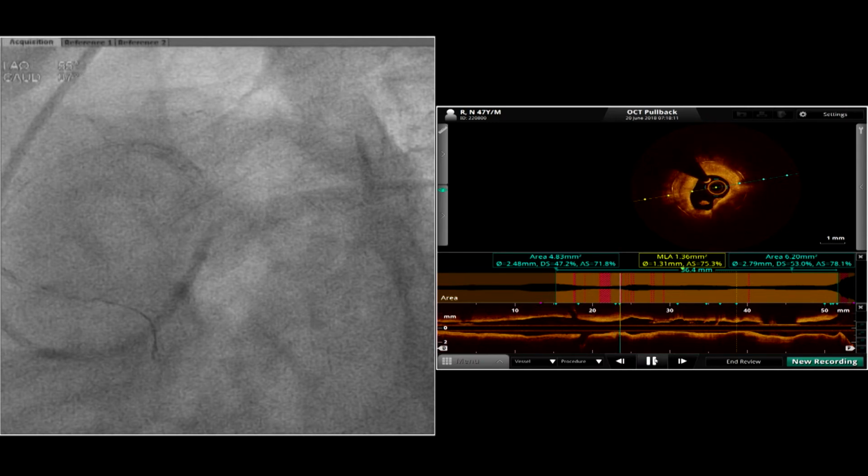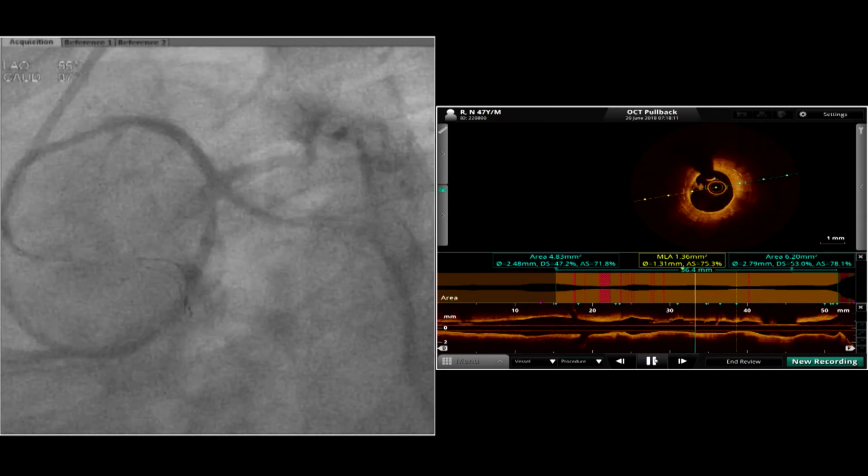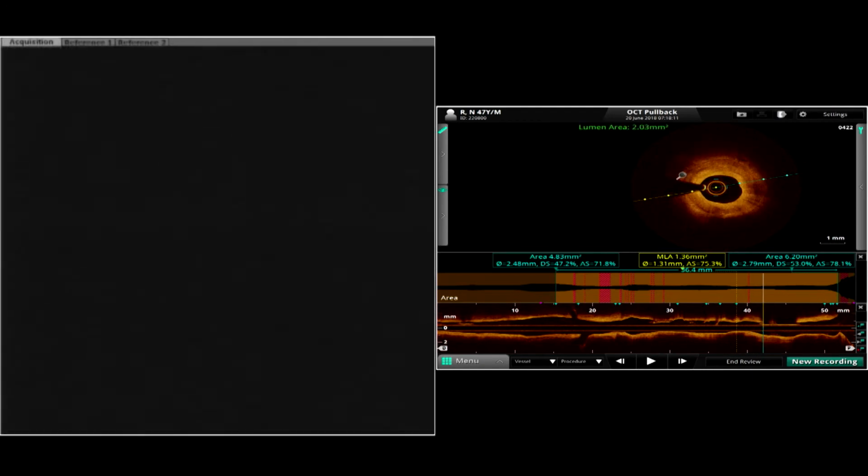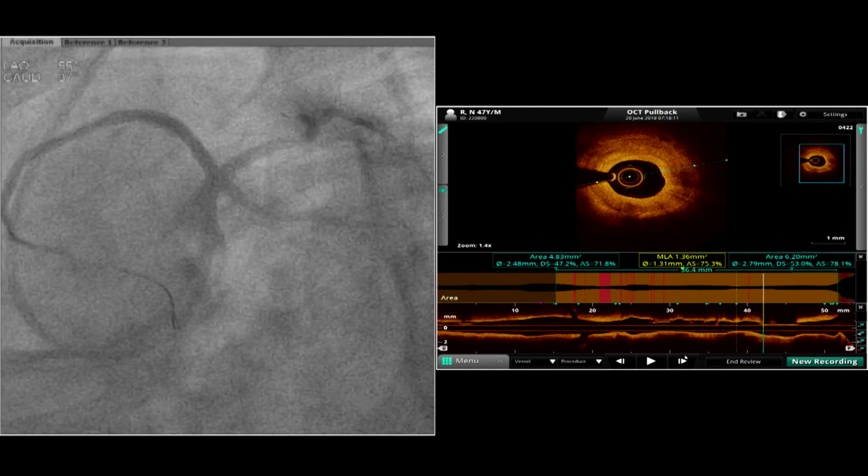And here, I agree with your suggestion that there is no way to escape without putting in a second stent. 3.5, 15. So what are your thoughts about the post dilatation now? I think you should definitely go for it, given that you're in the proximal part of the LAD, and then follow that with an OCT run to see what the stent apposition looks like. Yes, 3.5, 15.